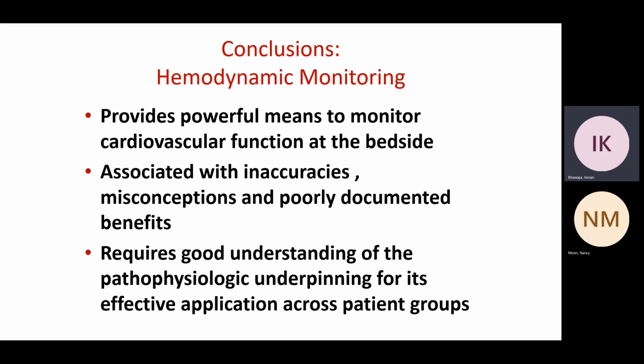You can gather a lot of information, with direct measurements and many calculated parameters derived from them. But there are inaccuracies with the measurements, misconceptions, and poorly documented benefit and potential harm. You need a very good understanding of physiology and pathophysiology to gather your information accurately and, more importantly, to apply it to your patient in the right direction.